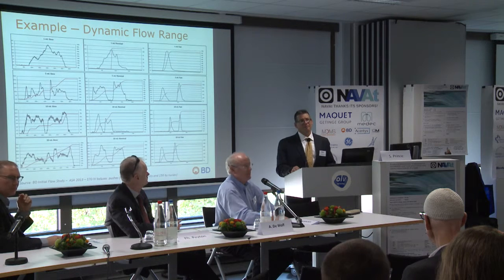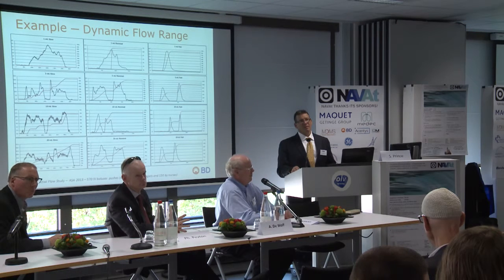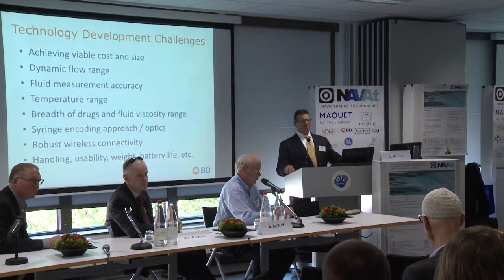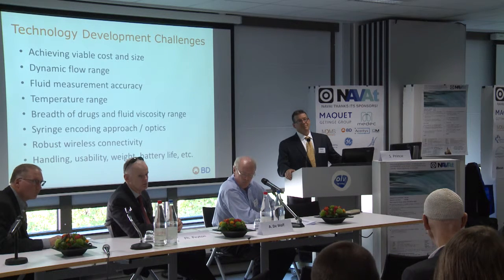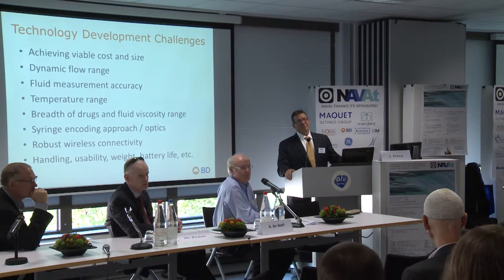Thank you, Dr. Sakana. And then I just want to ask, since I'm here in Europe, I have a question. In the United States, we have something called USP 797, U.S. Pharmacopoeia 797 rules for compounding, which state that when we draw up a medication at bedside, if you're going to administer a drug after an hour, you've got to label the syringe. If it's right away, you don't. It has rules about how you draw.